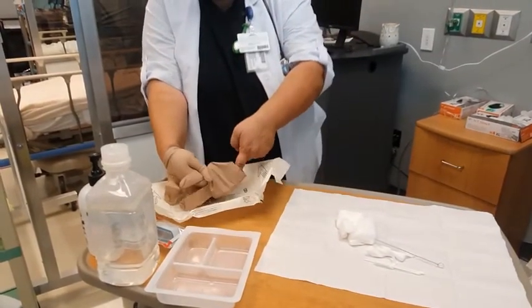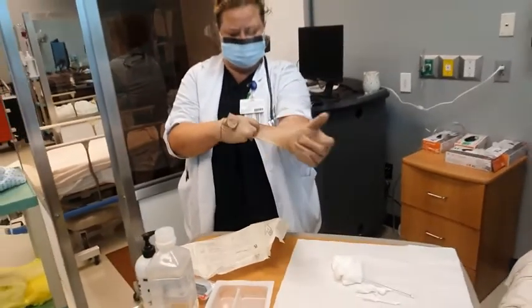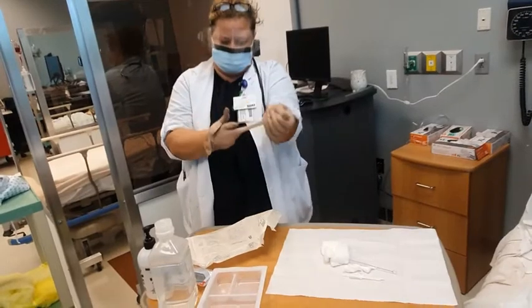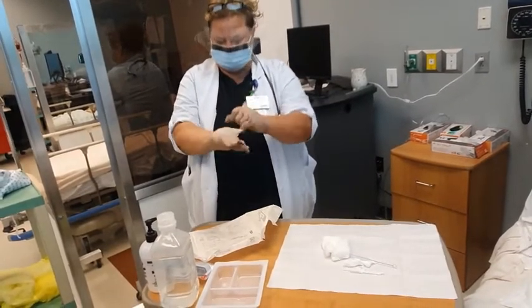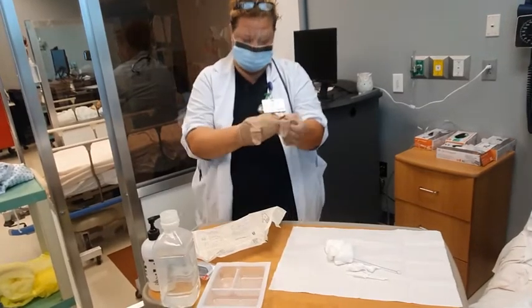Trying to open it up with one finger. And just realize, when you're putting on sterile gloves, the whole purpose is to make sure that you don't touch the outer part. You can always fix your fingers. This is something that's common. It happens a lot when you put the fingers in the wrong holes. Okay?